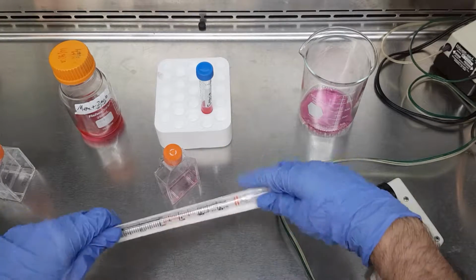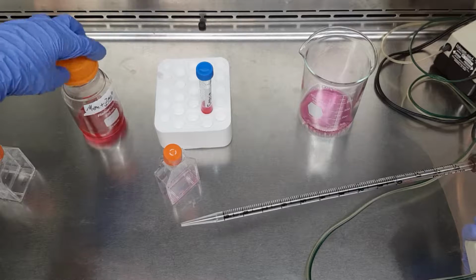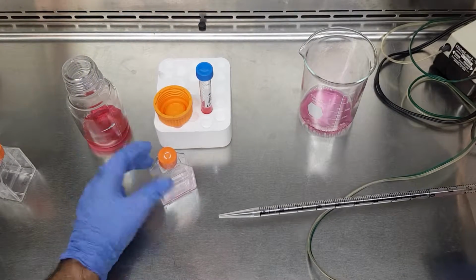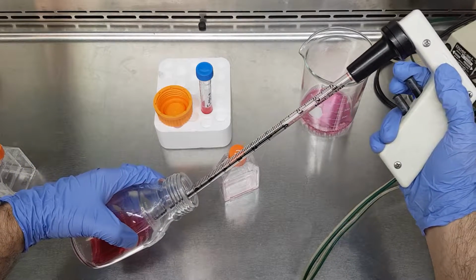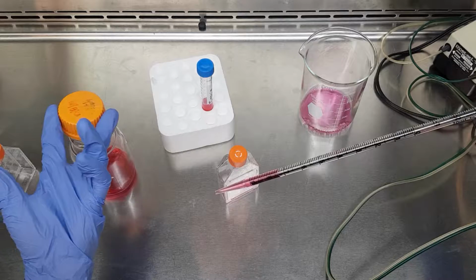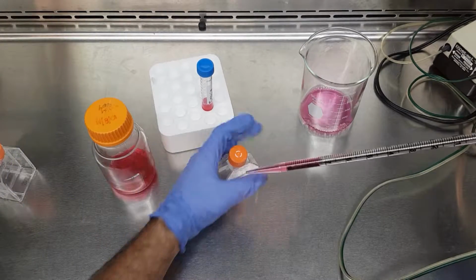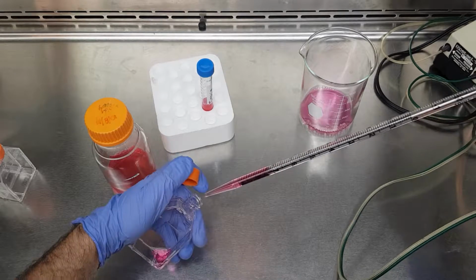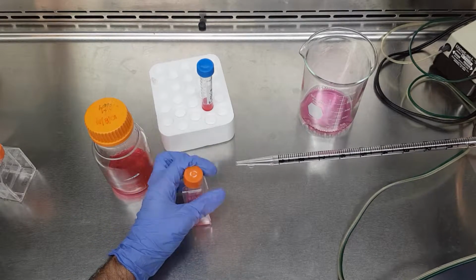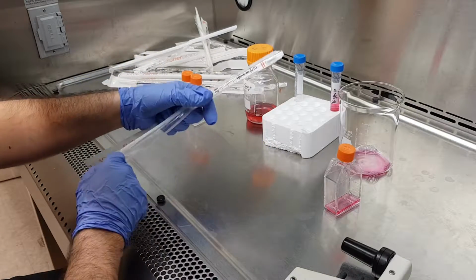Next, deactivate the trypsin using 2.5 milliliters of culture media with FCS. Pipette roughly 1/2 milliliter of cells into a microcentrifuge tube for a cell count.